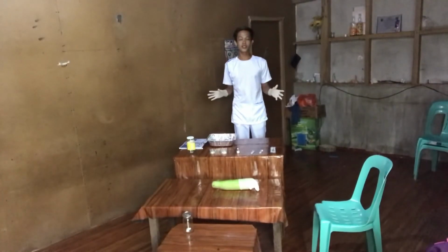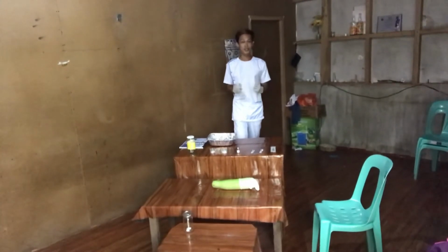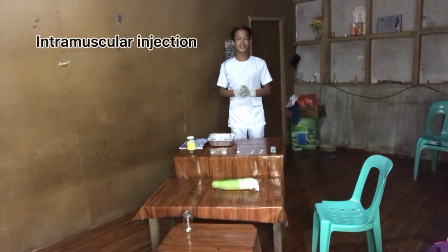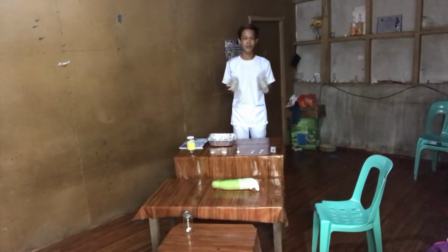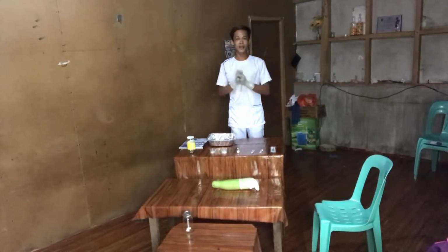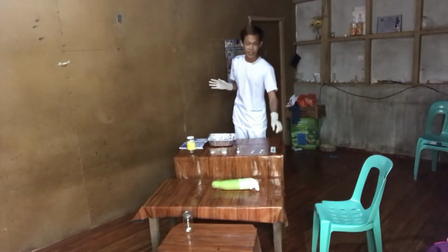So we are done demonstrating the intradermal injection, and for this time we are going to demonstrate the intramuscular injection. Intramuscular injection is the introduction of medication deep into the muscle tissue, where a large network of blood vessels can absorb it readily and quickly. To prepare the medication for the intramuscular injection, first we need to get the 23 gauge syringe.